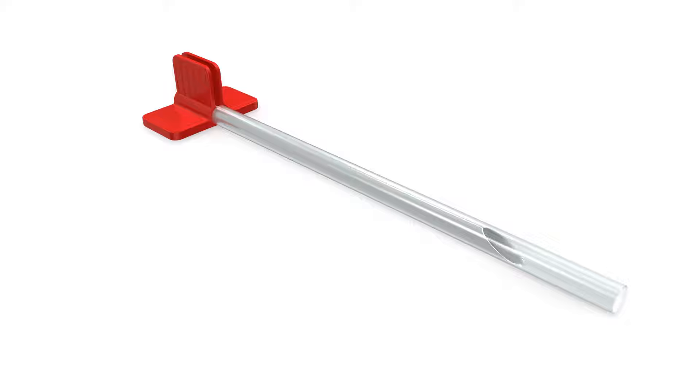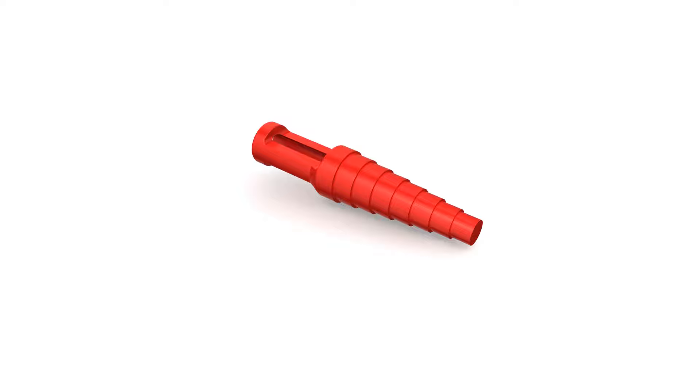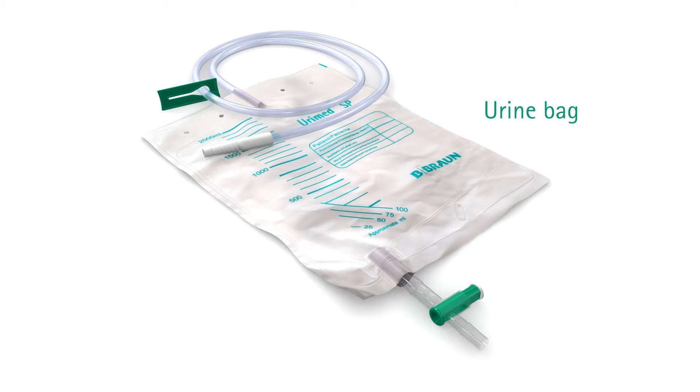Systofix puncture sets include a metallic splittable puncture cannula with its protective sheath. The set may also include a red catheter stopper or a two-liter urine bag depending on the reference.